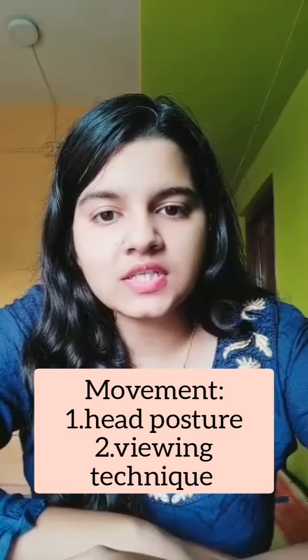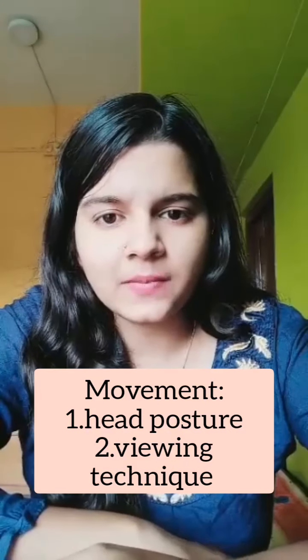So basically, the aims and results of a low vision patient examination are quite different from the normal vision test, because the first thing that we should notice is the general movement of the patient, like if he or she is very much affected by bright light, or if he or she can navigate themselves to the consulting room, and do they have any physical infirmities like hand tremors or etc.